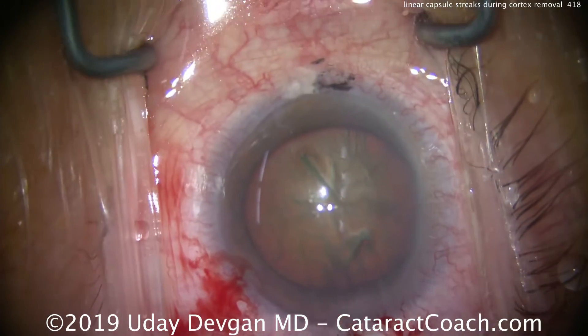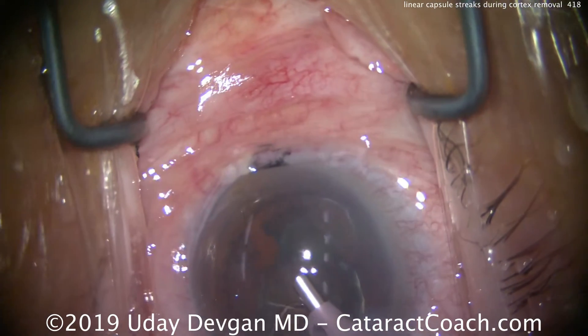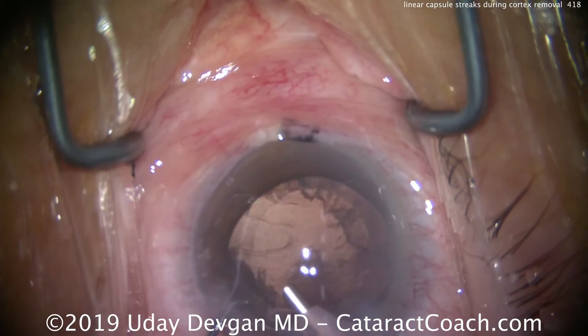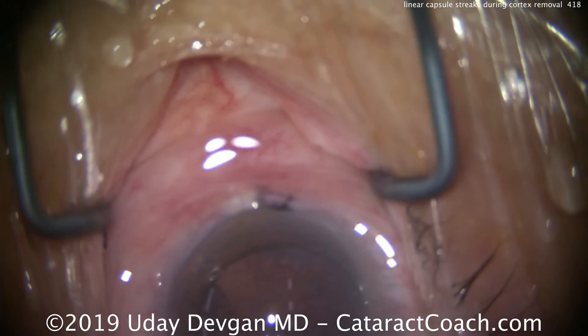This is an elderly patient who's had a cataract for many years. Nucleus removal goes fine. End of the nucleus removal — phaco probe taking out the last bit of lens nucleus. Looks pretty good, a couple little bits floating around. No issue at all.